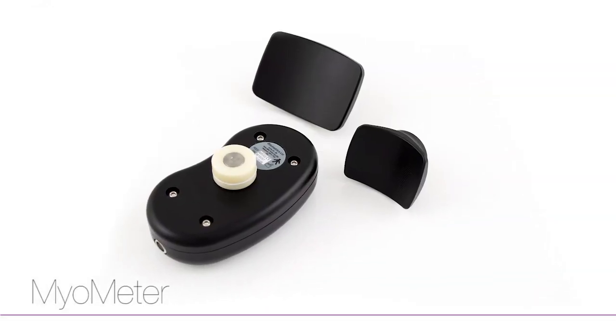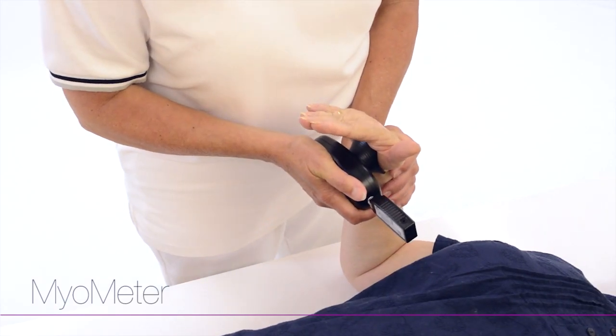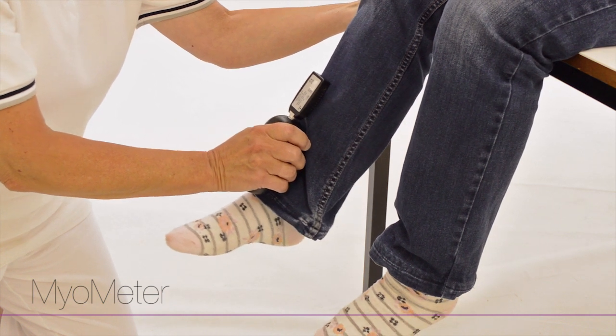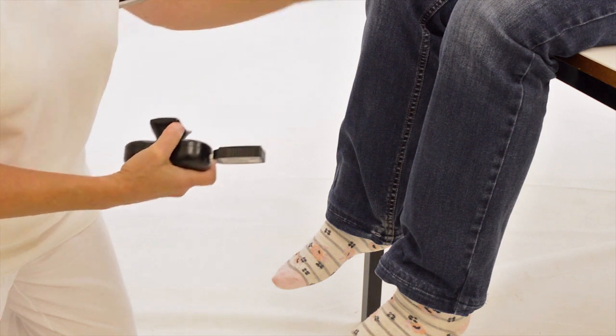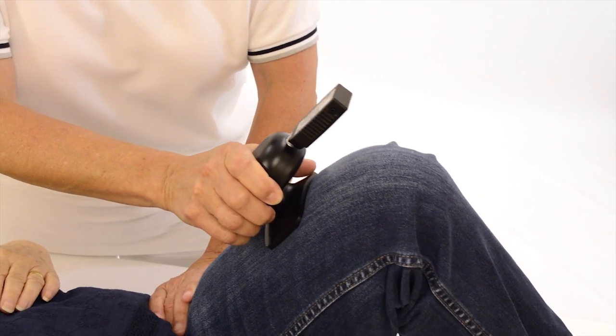Manual muscle testing is one method by which muscle strength is defined, and the e-link myometer is ideal to assist in this test as it accurately and objectively quantifies the force applied. Performance over time is easily evaluated and the software readily exports data as required for research purposes.